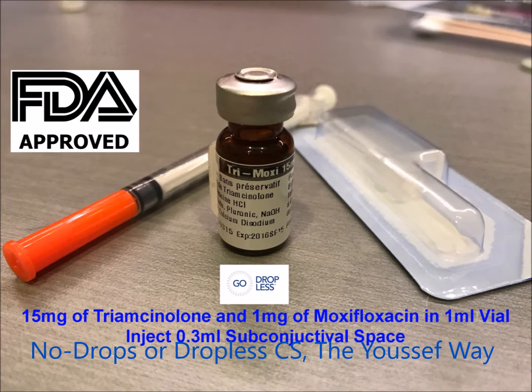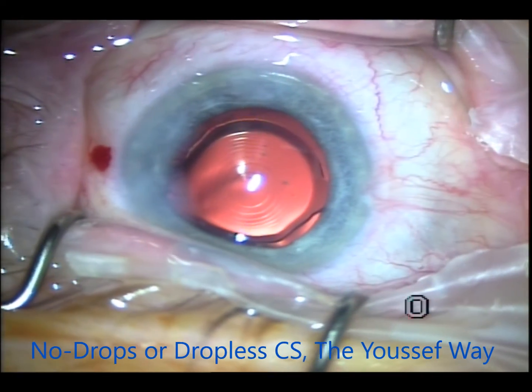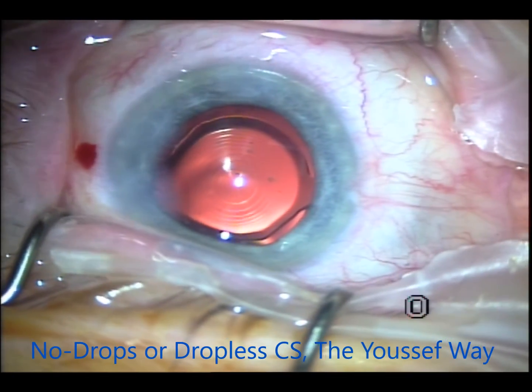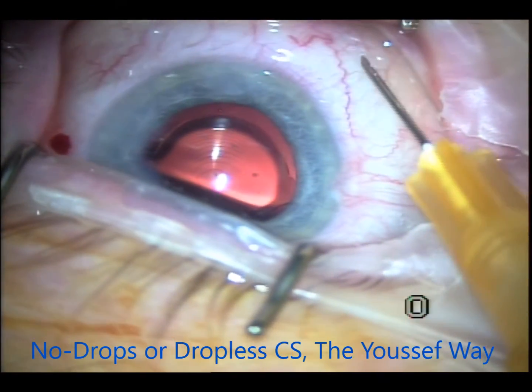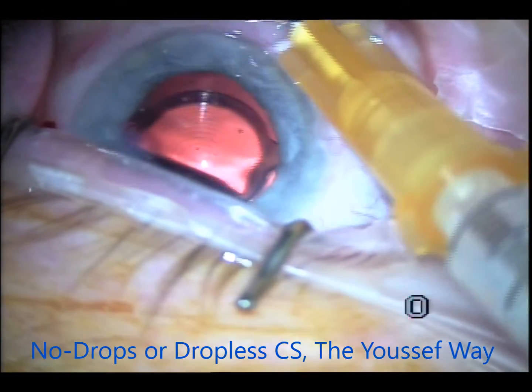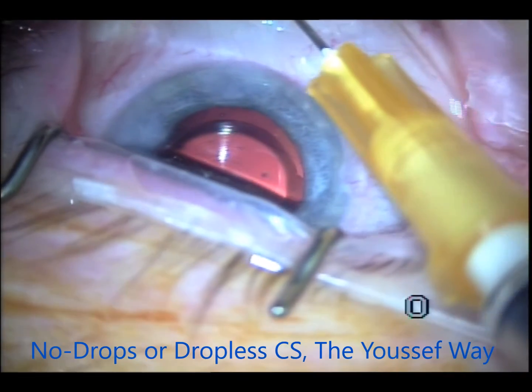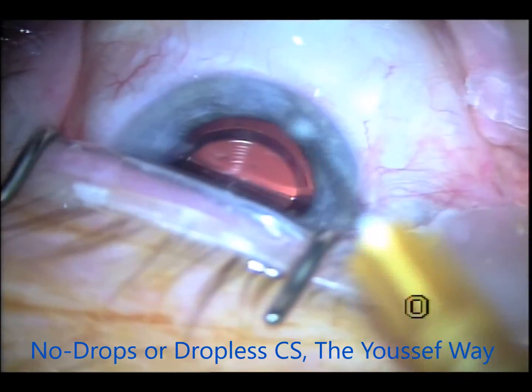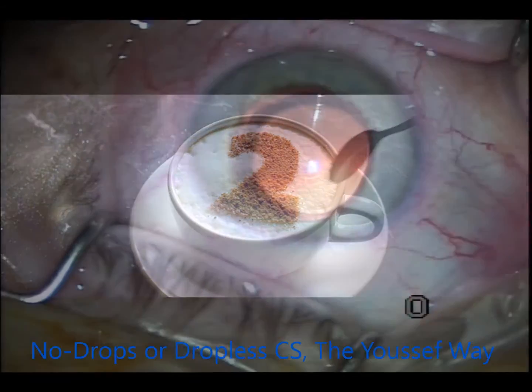The Tri-Moxie is a mix — originally injected intraocularly — but I use it a little differently because the intraocular route causes foggy vision for a few days. This is an easier method: I inject it in the subconjunctival space with the same exact effect, without the foggy vision for a few days after surgery.